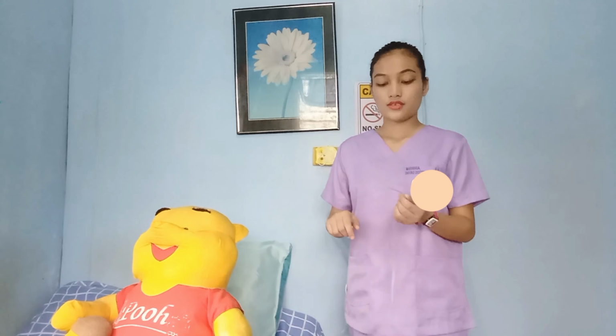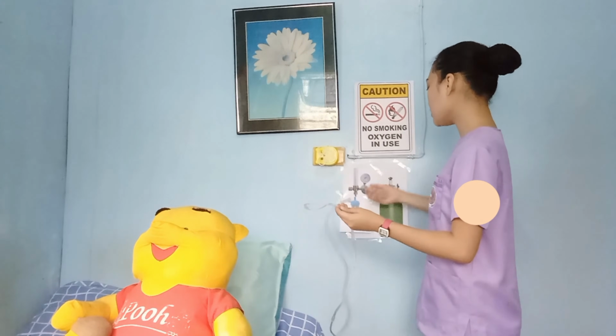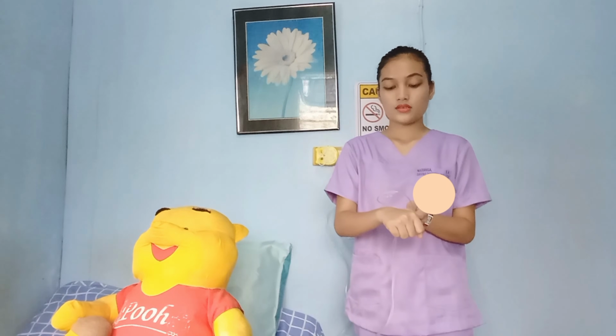And you should feel the oxygen coming out of the cannula outlets. Okay, so I'm going to turn on my oxygen and then feel for the oxygen coming out of the outlets with the back of my hand.